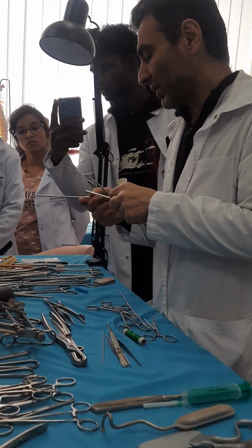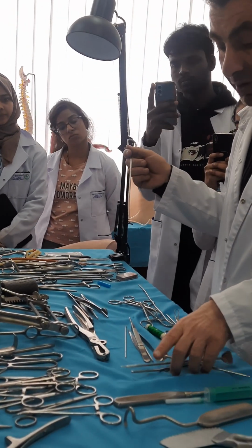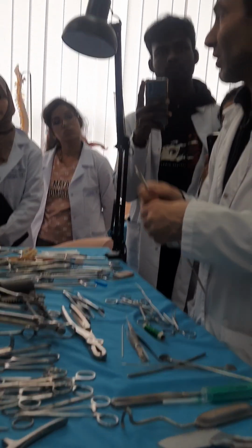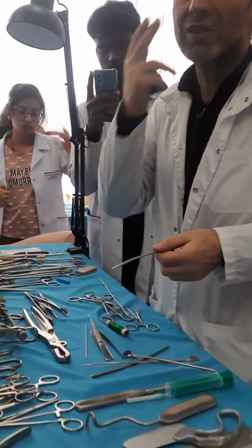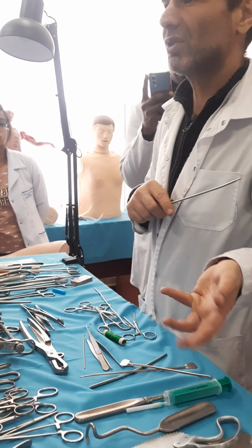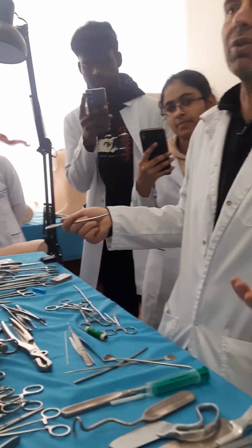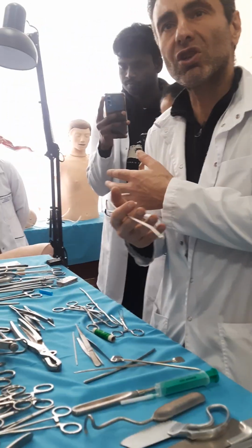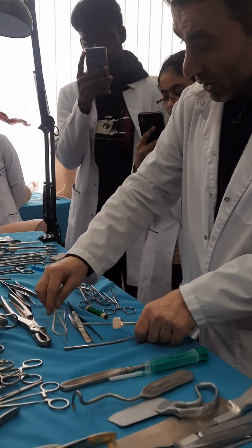Absolutely blunt, and we have measurements in the body. What is the main purpose? Cavities, fistulas, stomas. Let's say, for example, a child has inserted a toy in the nose. You can measure how deep it is and what its position is. Or you open the fistula to the outside, but God knows why it is closed. Say, there are stitches or a scar or something like this. You can detect, you can check.